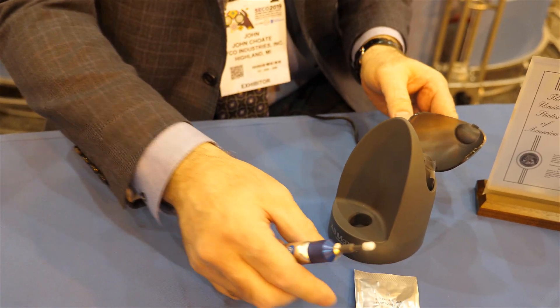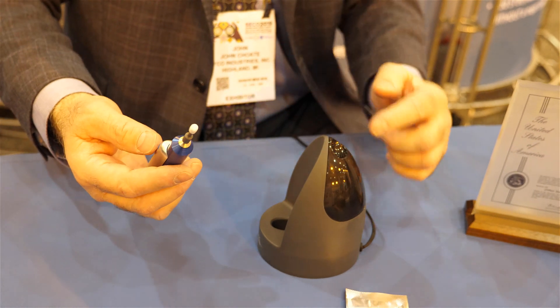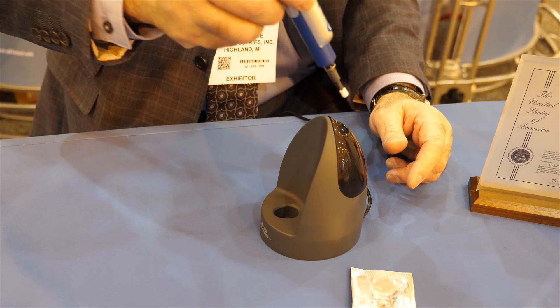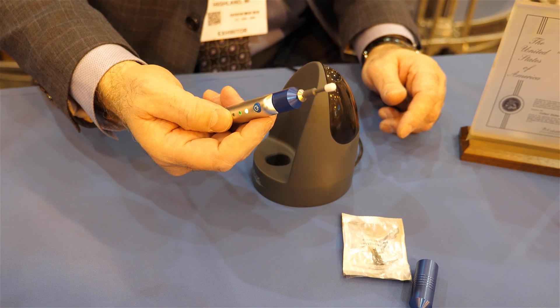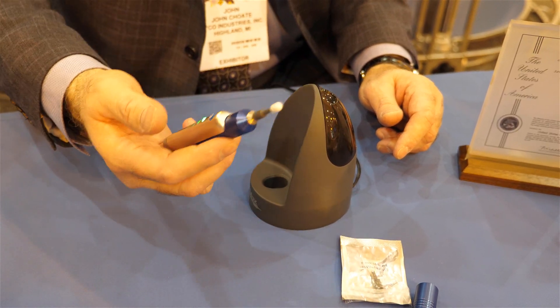Once the device is assembled and the tip is in place, the doc or technician can clean the reservoir and fill it with lid scrub solution of their choice. Soak it, saturate it until it's soft. Then they press and hold the button for a couple of seconds until it turns into forward mode. They would debride the outer eyelid margin as appropriate.